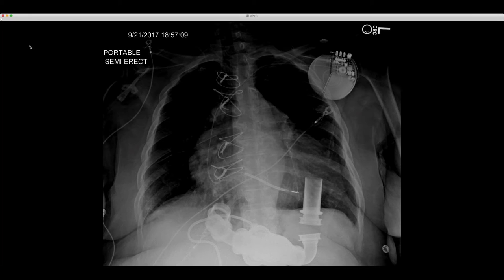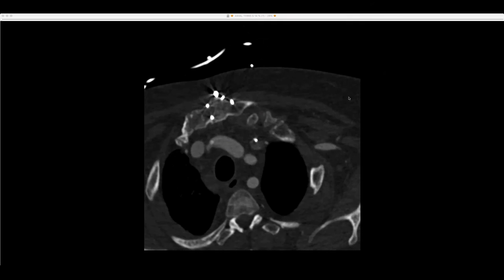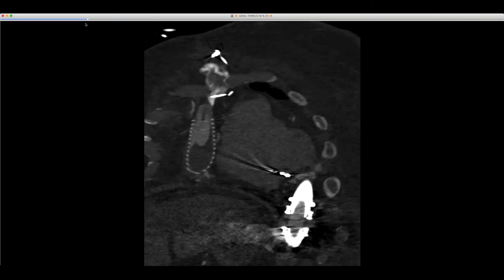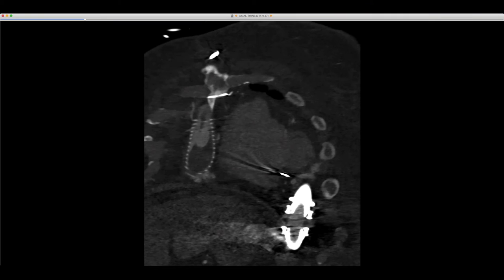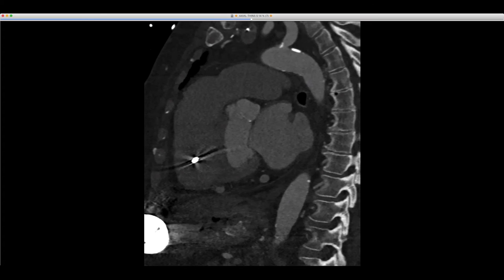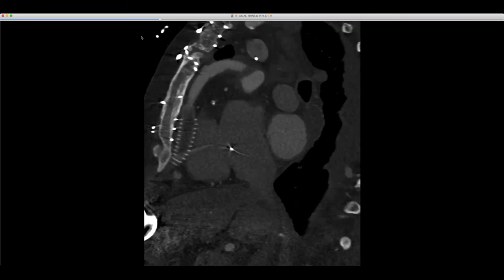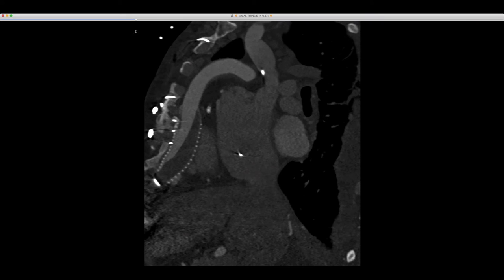So ordinarily there's no communication between the blood-containing lumen of the outflow cannula and the wrap, as you call it. But somehow that was created, so blood went into a space that should normally contain nothing and clotted there. Right. We've seen a number of these where fibrinous material, presumably due to a little micro perforation into that wrap, doesn't really narrow the lumen. It just creates a concentric ring around it and creates no compression.